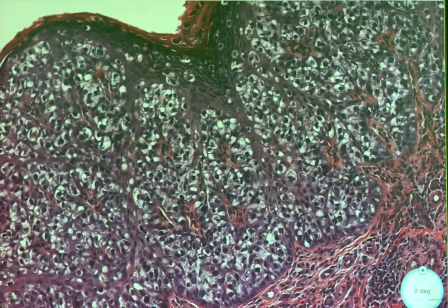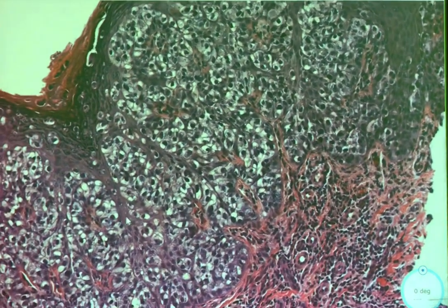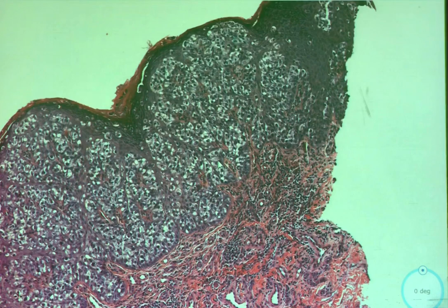Mammary. Mammary. So I didn't show you a picture of a breast, did I? No. So then what do we call this? Extramammary? Yes, so this is extramammary Paget's. Are they normally this many? I thought there were fewer. This is really obvious.